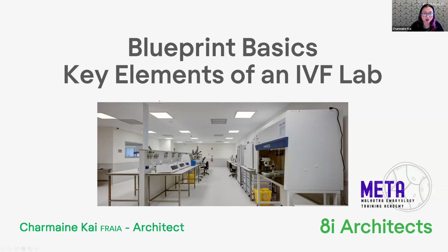It has been designed with most of the modern principles. This was finished about 2 years ago. As you can see, it's been set up with time-lapse incubators. We've got the hoods, so it's a combined andrology and embryology lab.